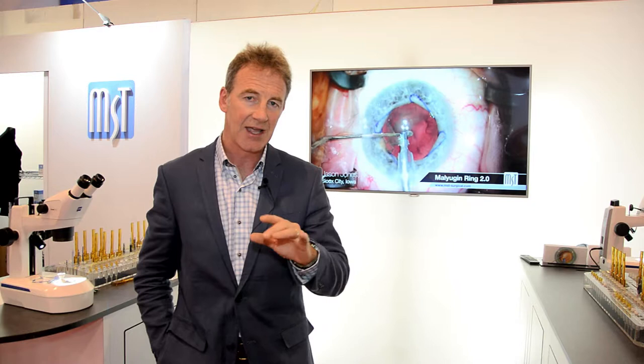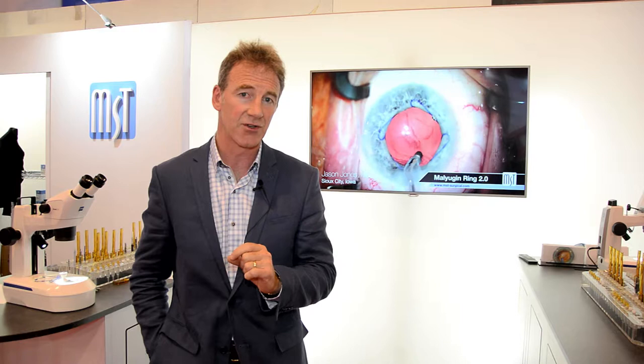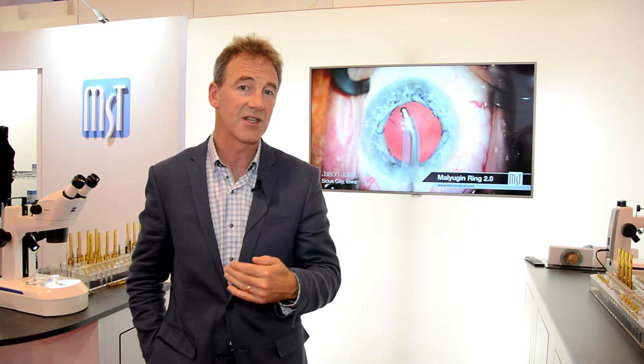When it comes to the malugan ring, there are lots of videos on the internet of how to place the malugan ring, but only when you've done it yourself in a simulated situation should you then go on to use them in live surgery. On the simulation gallery, which is part of the simulated ocular surgery website, we've got videos of how to put in these devices correctly and also incorrectly so people can see what the pitfalls are.